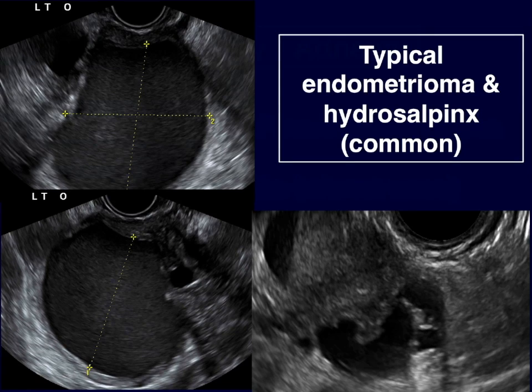presentation of endometriosis as we see it by ultrasound is the endometrioma, which you can see here measured on the calipers. It's a cyst that has relatively smooth wall, but not always. But it has that characteristic low-level ground glass echoes that is unclotted blood, if you will, of the inside of the endometrioma.